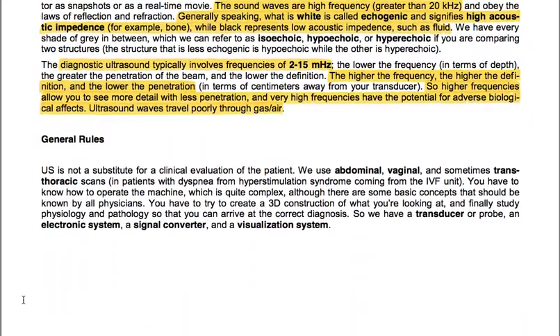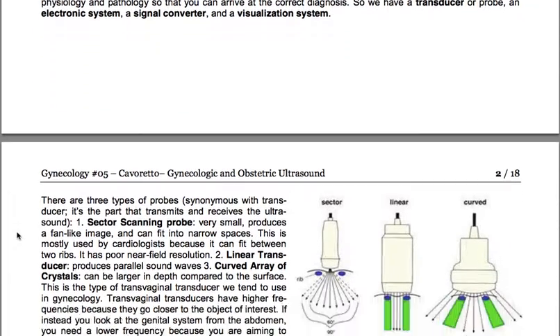General rules. Ultrasound is not a substitute for clinical evaluation. Use abdominal, vaginal, and sometimes transthoracic scans in patients with dyspnea from hyperstimulation syndrome coming from the IVF unit. You have to know how to operate the machine, which is quite complex, okay? So we have a transducer or probe, an electronic system, a signal converter, and a visualization system.